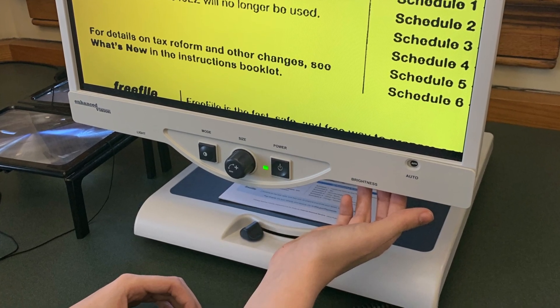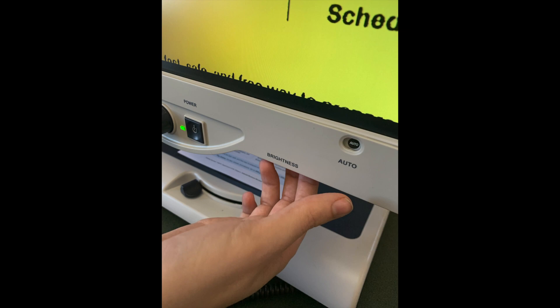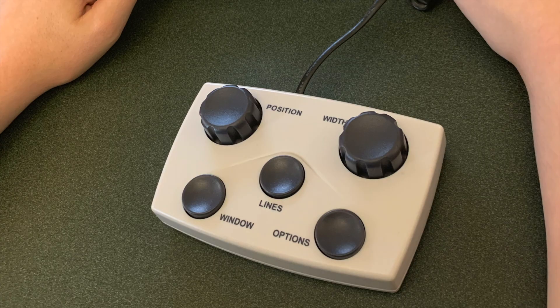The system also has a lever to control the brightness. Along with these three controls on the screen, the Enhanced Vision Merlin comes with a small remote control with two dials and three buttons.